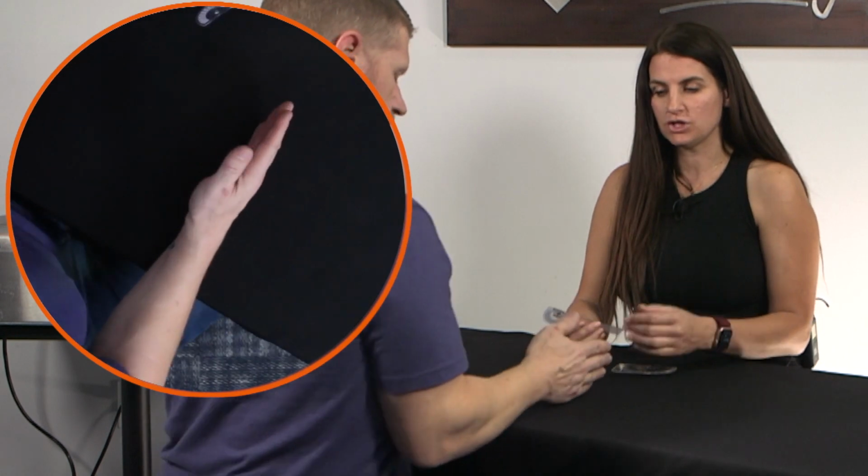All right, now we're going to show how to do standardized goniometric measurements. We're going to start at the forearm and move distal. We'll begin with forearm rotation. So first we'll do supination.